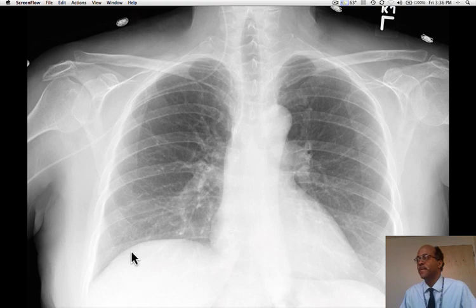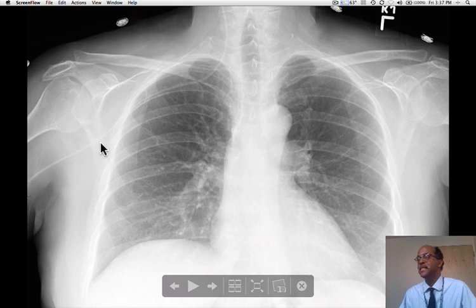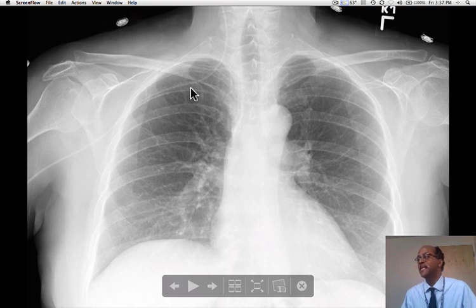We're going to begin with this first case where a peripherally inserted line, a PICC line, has been placed and it should have its tip in the superior vena cava. Here is the line — it's on the right-hand side. Here is the subclavian vein, and we can see that the line, instead of turning downwards and into the superior vena cava, has headed cephalad.